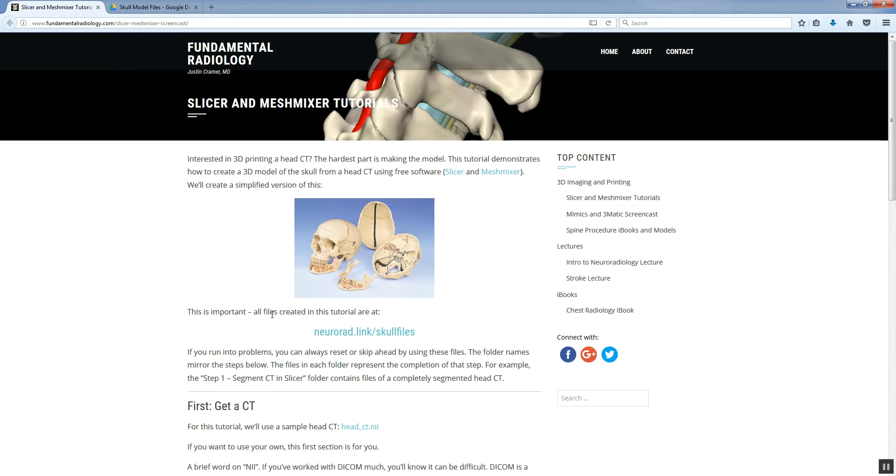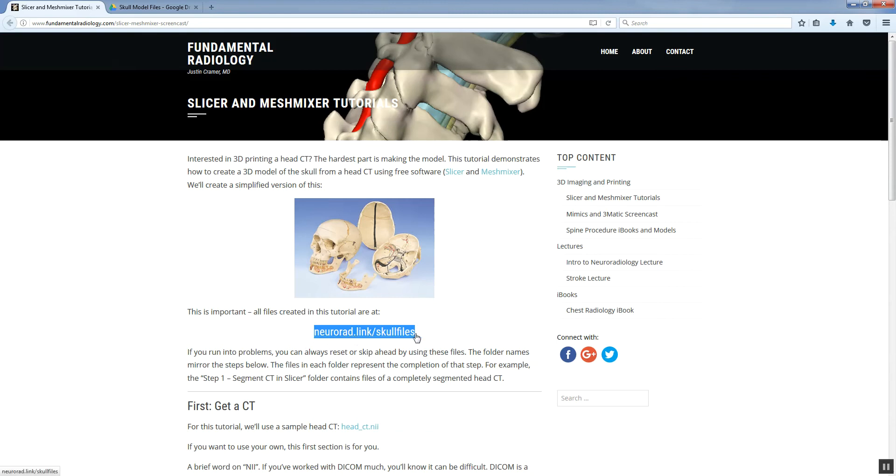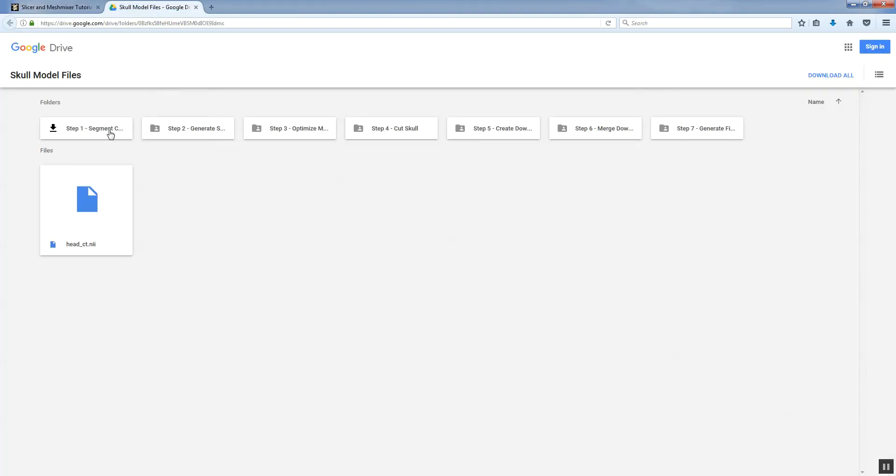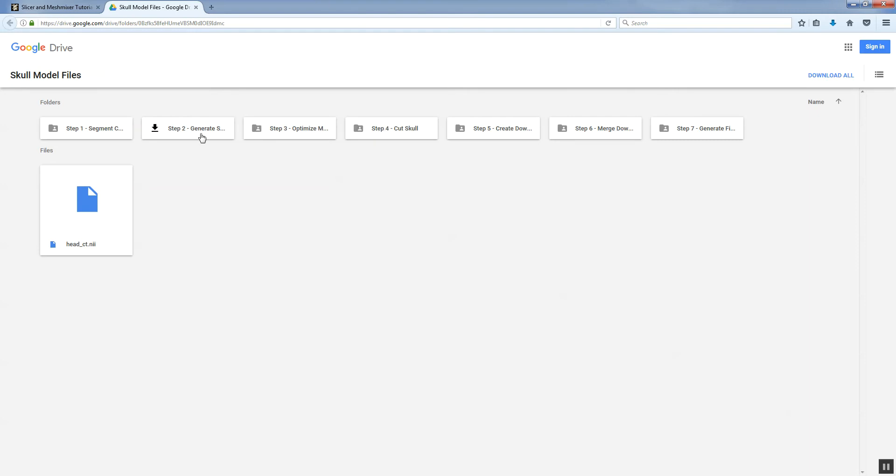Once you do and you're ready to go, the next thing to be aware of is that all the files for this tutorial are shared through Google Drive at neurorad.link/skullfiles. If you go to that location, you'll see that there are multiple folders that are named according to the steps of the tutorial. For each step, the contents of that folder represent the completed tutorial. So step one is to segment the CT in Slicer. If you look at the files in that, you'll have a fully segmented CT.